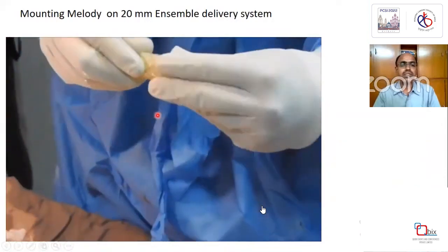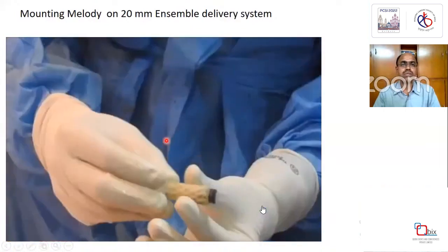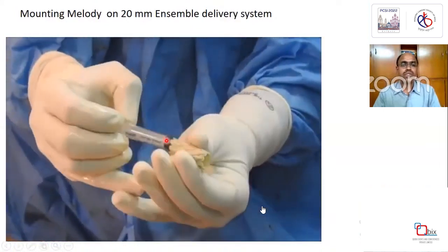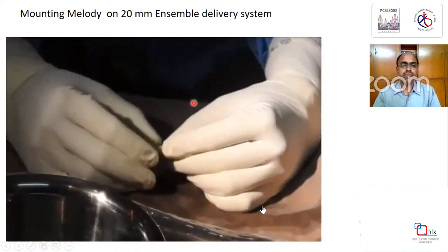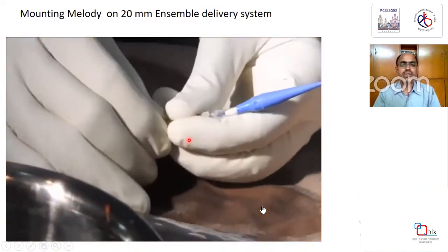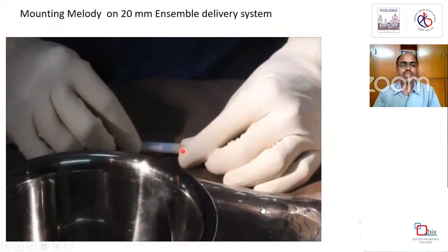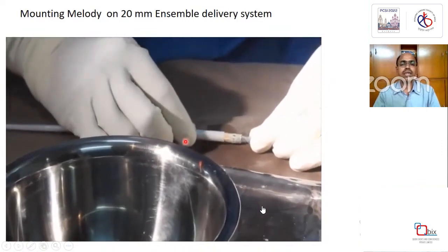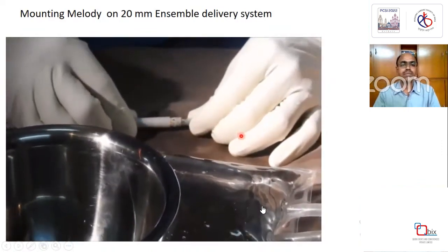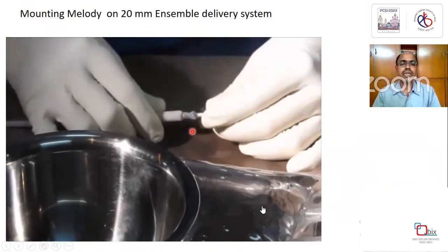The valve was good, and it is initially crimped on a 2 cc syringe, following which this was mounted on the Ensemble delivery system, hand crimped, not using any umbilical tapes. It's crimped by hand, and once it is crimped, we load it back into the Ensemble delivery system to see whether we can easily load it. We need to recognize that we have so far not done a pre-stenting.